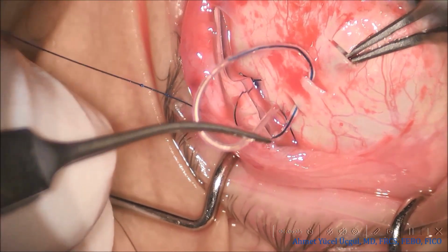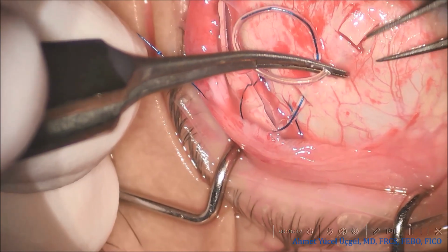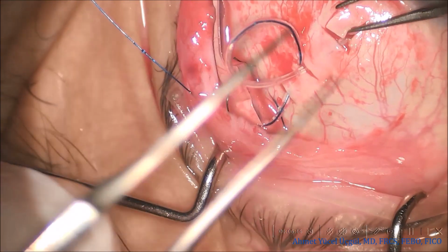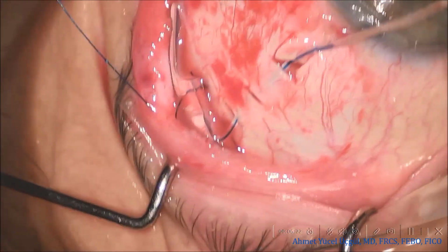Maintaining the tube at the same depth throughout its entire path is very important because it prevents bending or kinking of the tube along the scleral surface. In the post-operative period, this helps reduce mechanical stress during eyelid movements and serves as one of the most important protective factors against erosion of the overlying sclera.